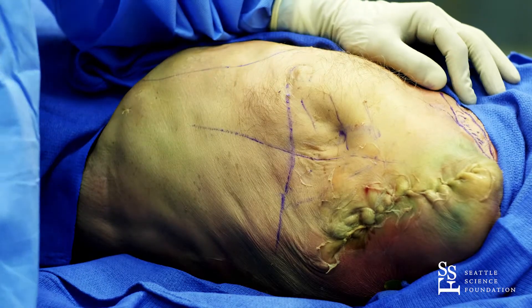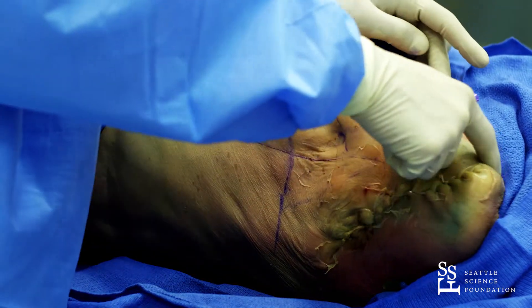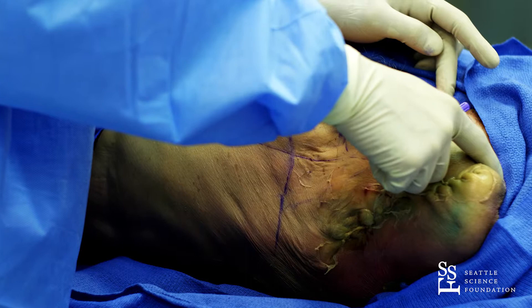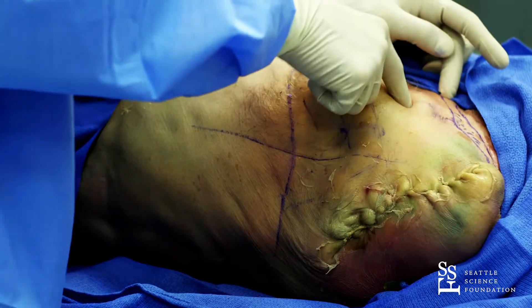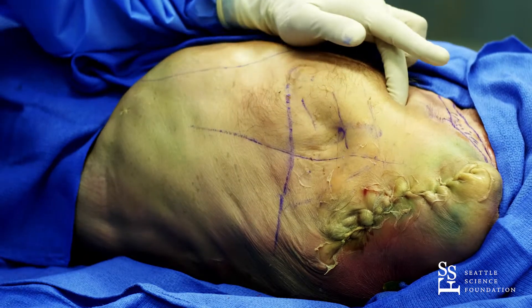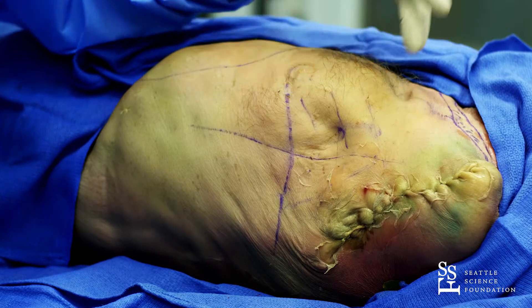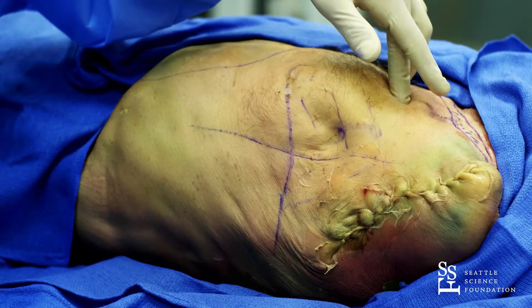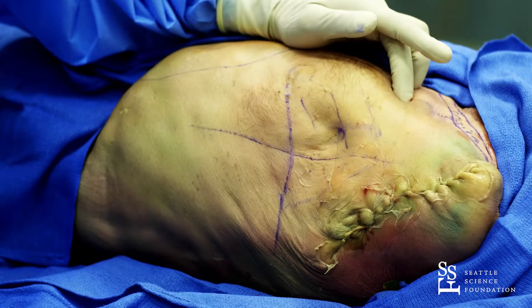There are basically two types of chest tube placements. The first one is according to Monaldi, where you use the mid-clavicle line and go in the second or third space between the ribs, especially when you want to do a decompression of a tension pneumothorax. But that is not a place where you put in a permanent or temporary chest tube.